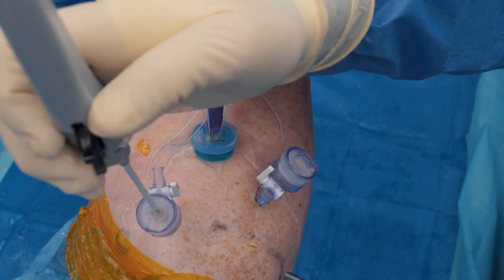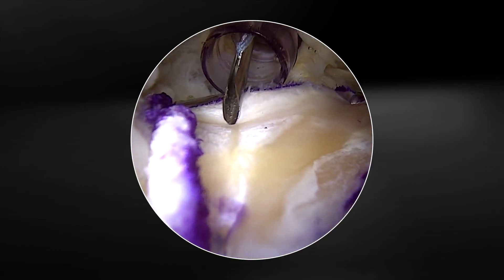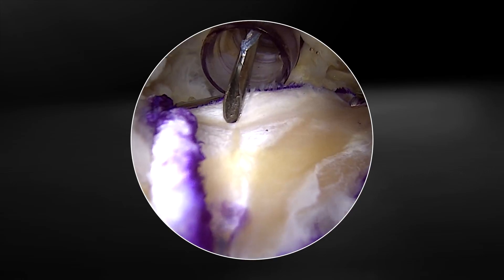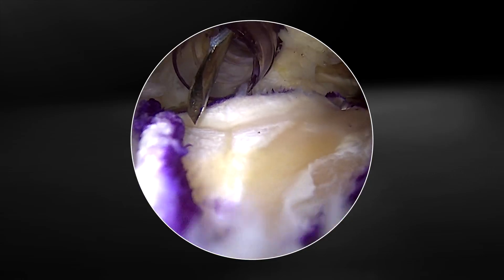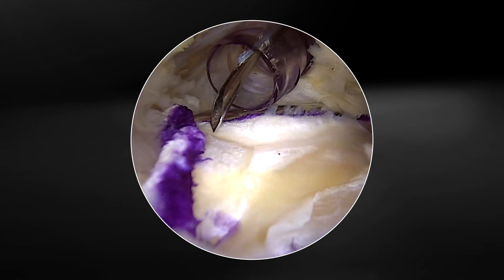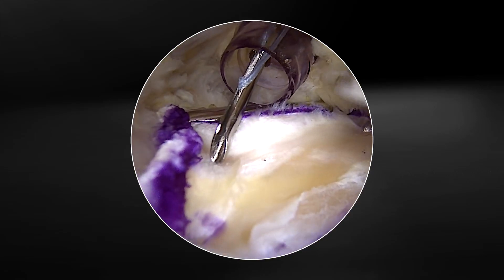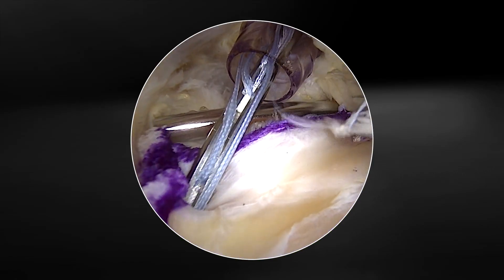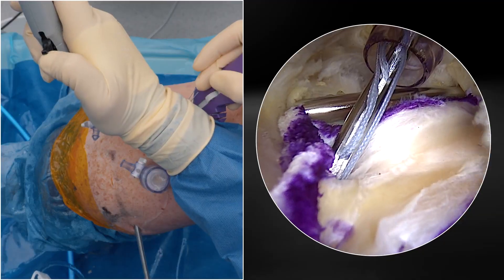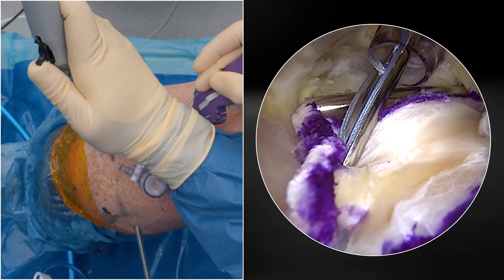The medial row can be fixed by using the standard anterior cannula, which we're demonstrating here. I prefer to use simple stitches so that it puts a little bit of tension on the graft. So my first stitch is going to come just inside the purple line. I'm going to insert the fiber stitch RC until it goes down to the depth stop, then rotate backwards outside until I get a very satisfying click.